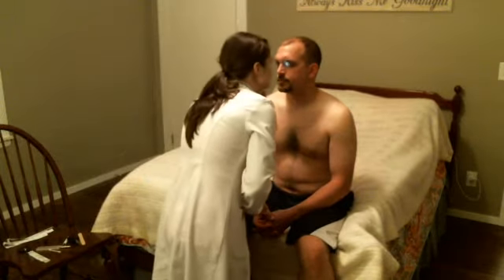Using my right eye, his right eye, I'm going to start at 0 on my ophthalmoscope and go in. Good. And the other side. The red reflex is noted in both of his eyes at this time.